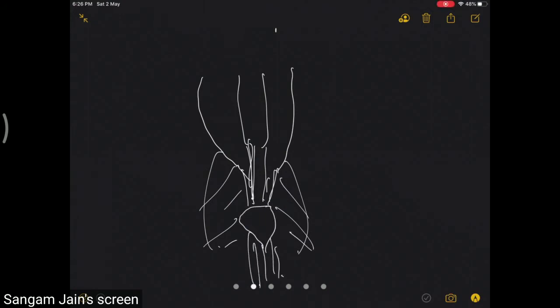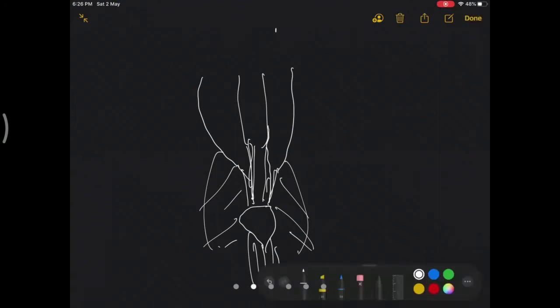Okay, so we go between the interval. We go in this interval, keeping around 4 to 5 mm of cuff around the patella and patellar tendon, between the rectus and the vastus medialis. So this is the classical paramedial approach, the medial parapatellar approach. It gives an excellent exposure, no doubt.